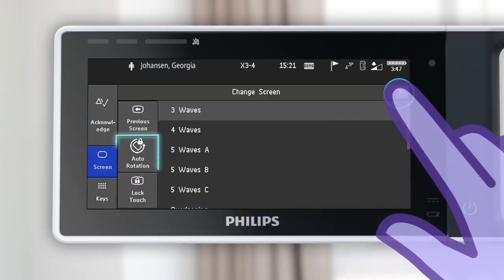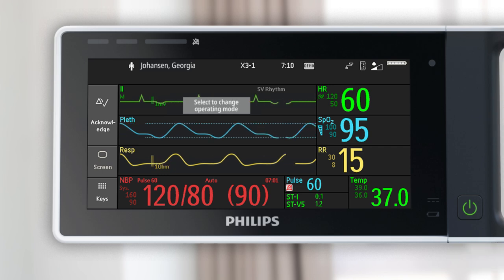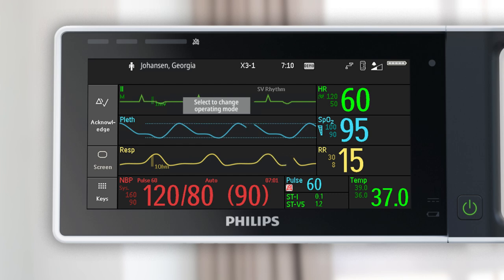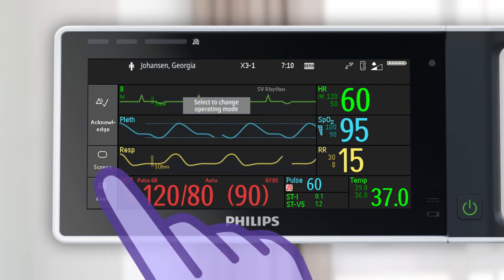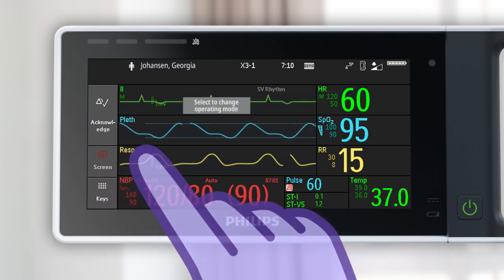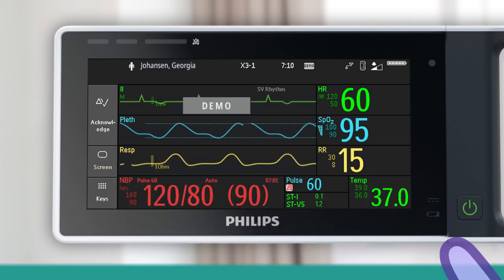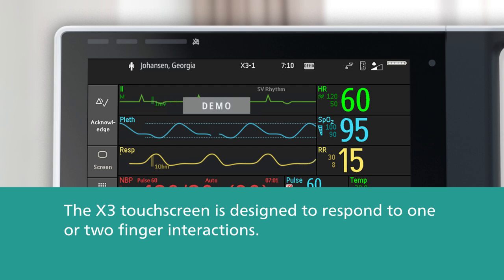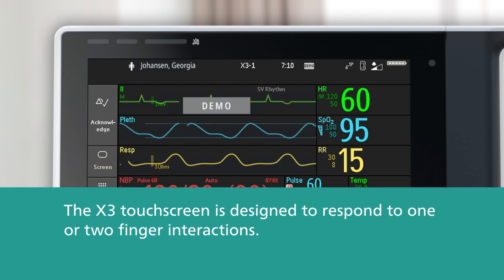You can also lock the touch screen to temporarily disable touch operation of the monitor — for example, when moving the X3 or during transport — so settings do not accidentally get changed. Touch and hold the screen key once to lock. To unlock, touch and hold the screen key, then touch confirm. Note that the X3 touch screen is designed to respond to one or two finger interactions to avoid inadvertent changes when moving the monitor.